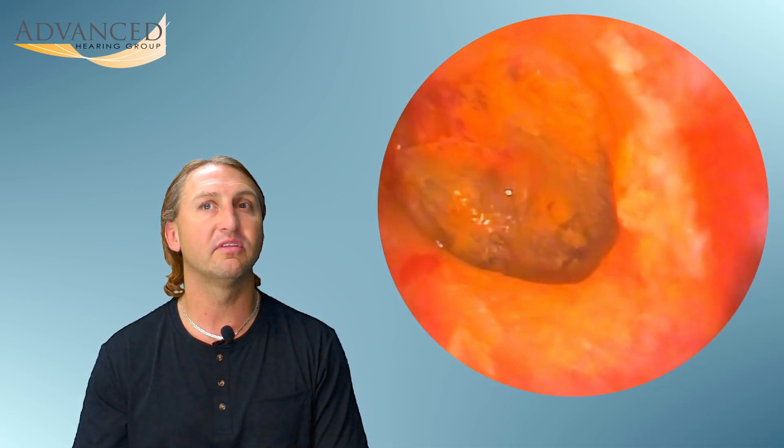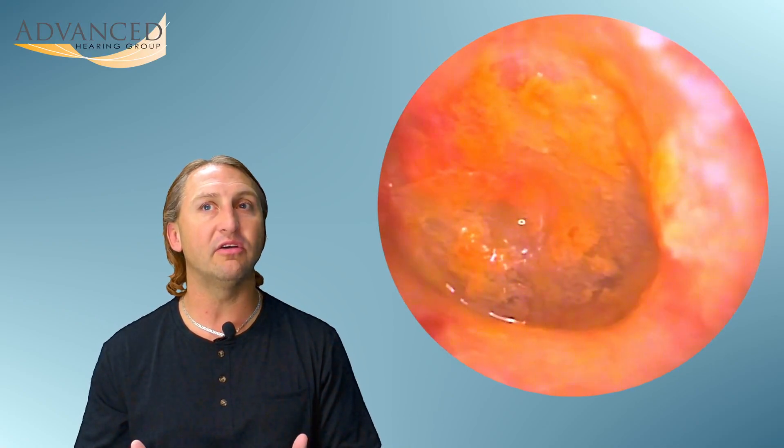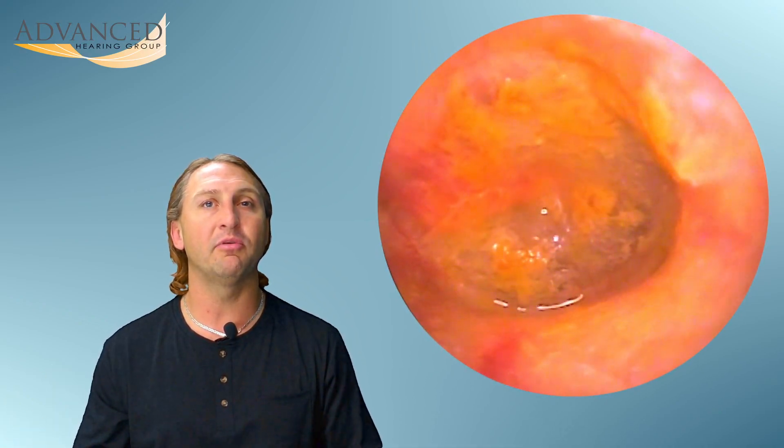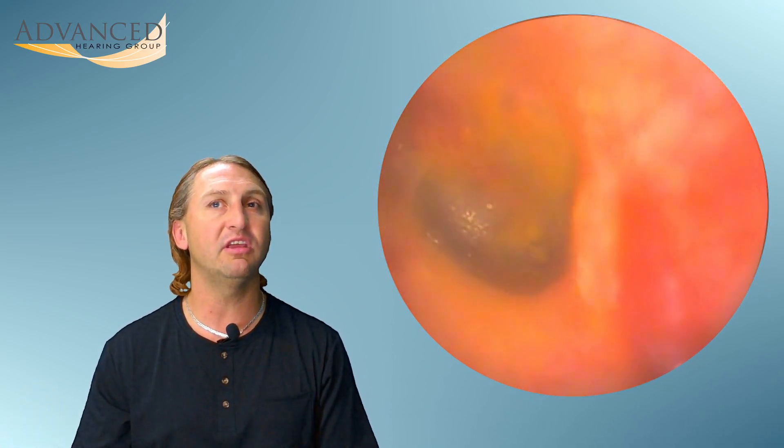Now we can see all the way down to the eardrum. It's a little bit discolored. There's a little bit more stuff down there kind of on the sides. Nothing major going on here. We don't really need to send this patient off to their primary care doctor. We did inform them that if the pain persists, we definitely want them to get seen by their primary care doctor.